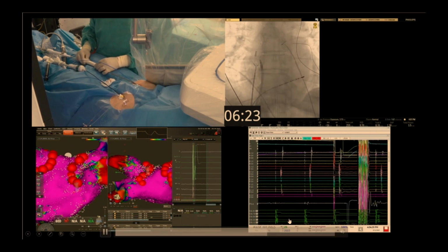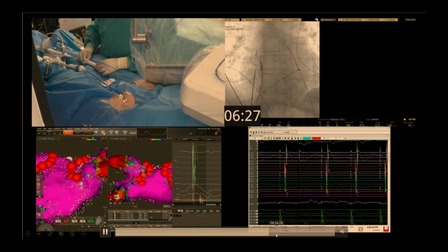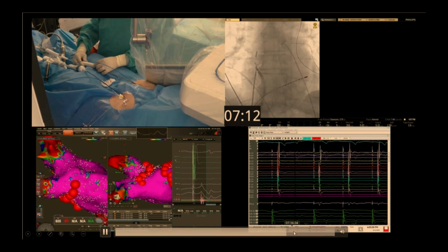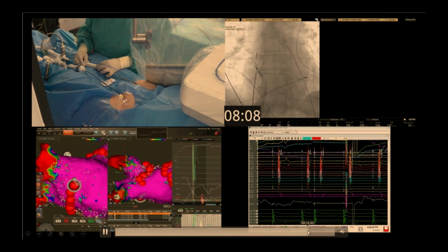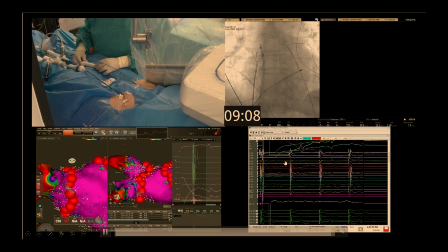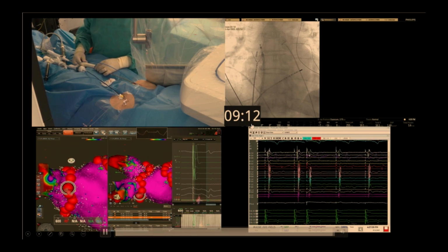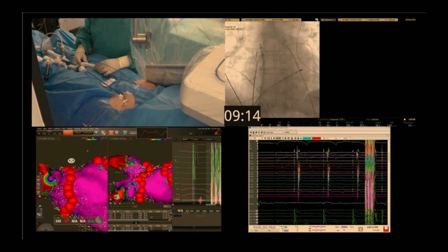So, in the interest of time, let's see how much time we have left. 15 minutes, that'll be enough. So I'm just going to skip forward here because you just saw me isolate the right side. And what you'll see is, let's see, yeah. So look at this. So we're at 9 minutes and 10 seconds in this case. So that's both quick. The left and the right?